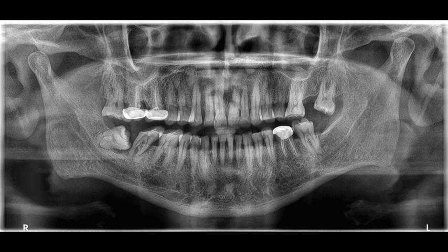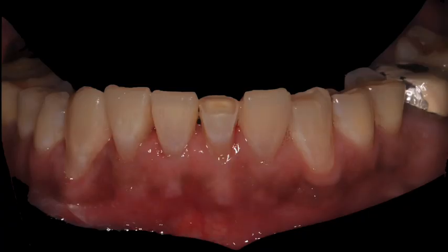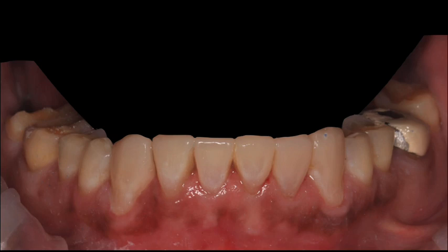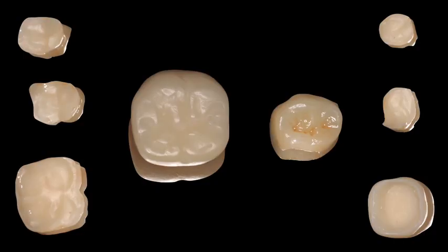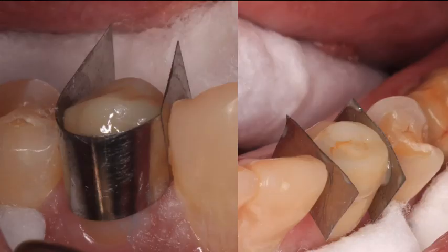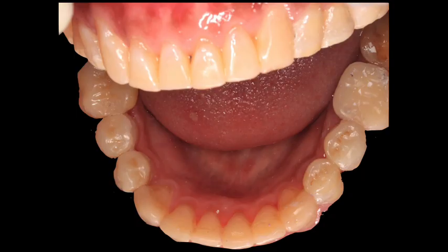We did a comprehensive treatment for this person with the crowns and all that, removal of the third molar, and tooth wear management, where we also did an injection molding technique, followed by onlays on the posteriors. These are zirconia onlays cemented with resin modified glass ionomer. This is a new case, it's been ongoing and is being monitored very closely. This is how it is done during cementation, making sure the teeth will be easier to clean. And this is how the patient's dentition looks now, and we are in the monitoring phase of how these zirconia onlays would do.